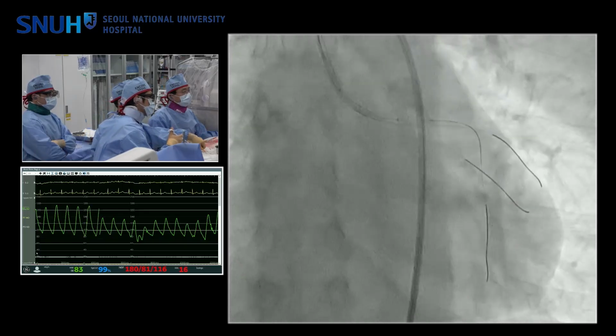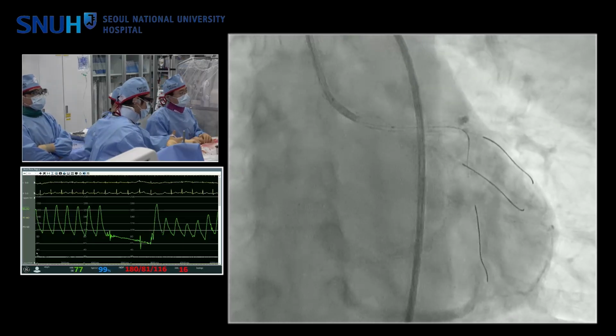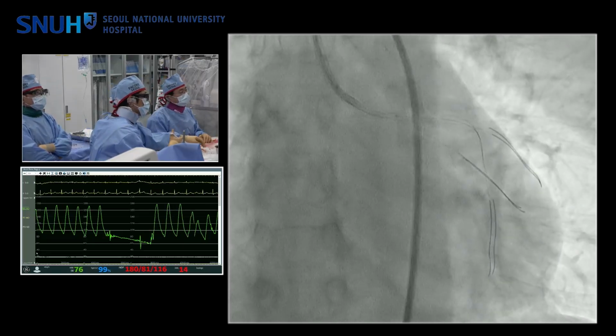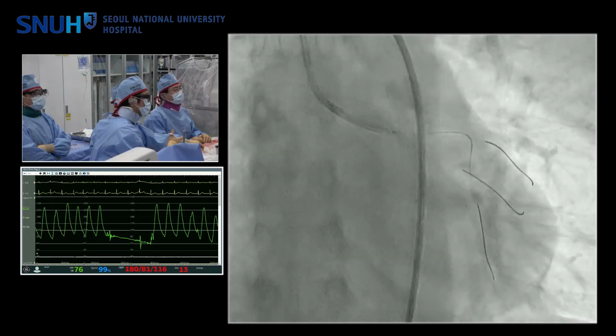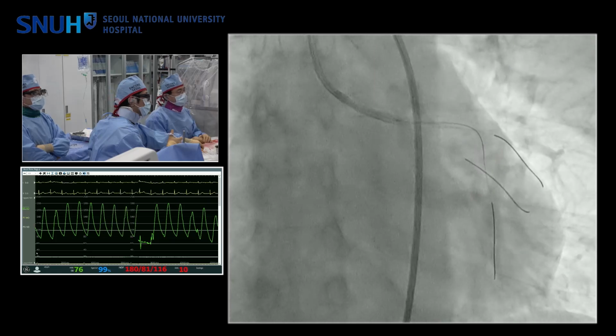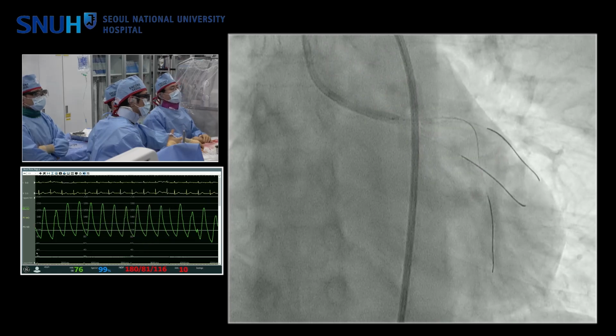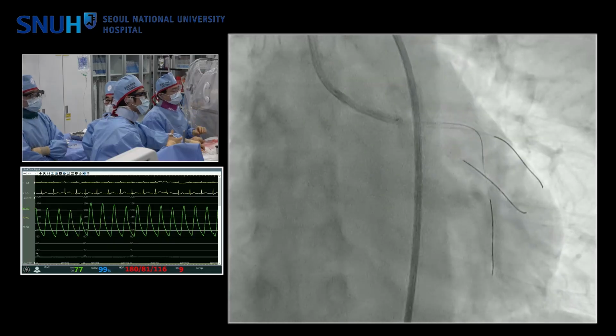So even in negative remodeled cases, you use the DCA. In negative remodeling cases, plaque burden is not so heavy. Sometimes during DCA, vessel size expands gradually. In such a situation, DCA is possible. Is 18 the maximum? 20.